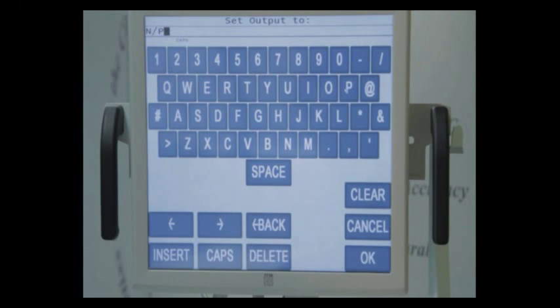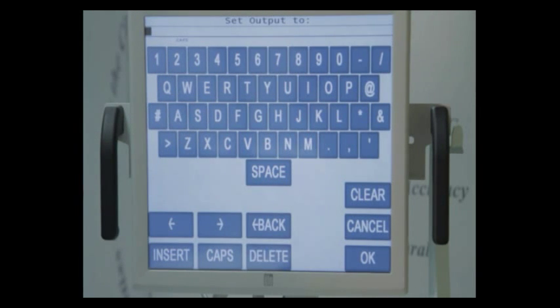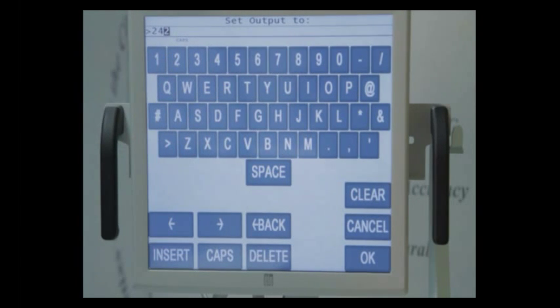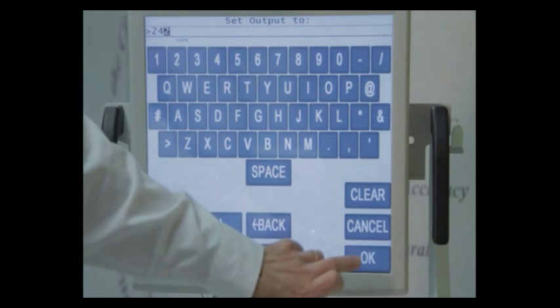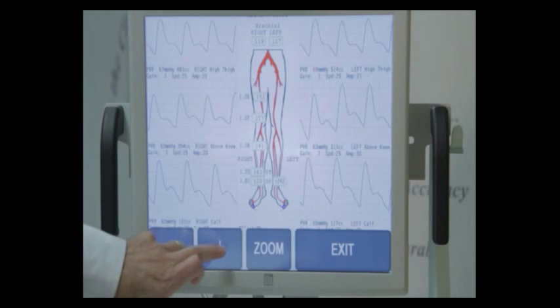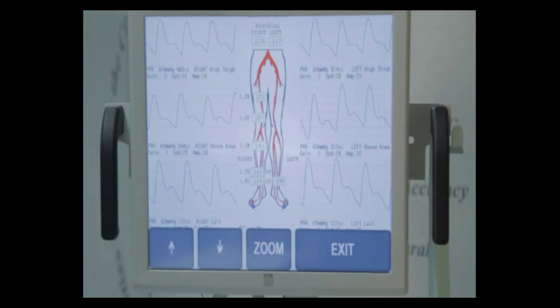I'm going to clear this. Some people like to use the greater than sign and greater than 242, which is maybe where they cut off. This will appear on the report as greater than 242.